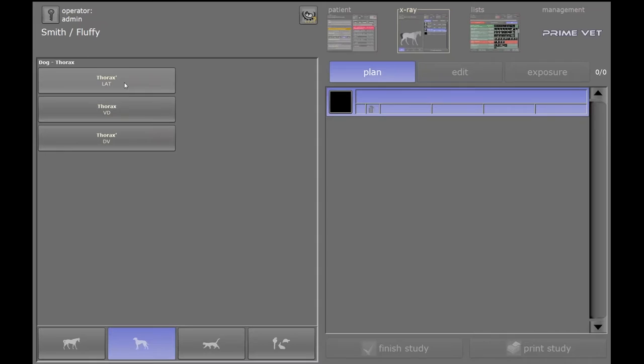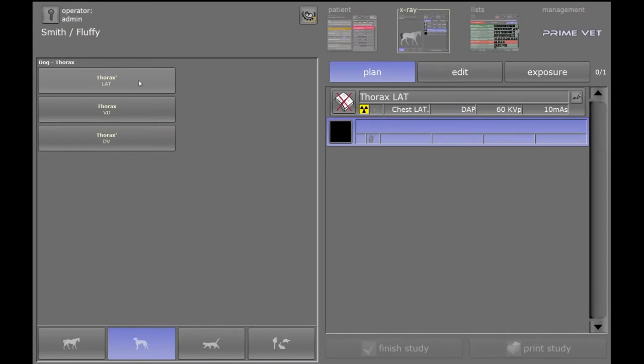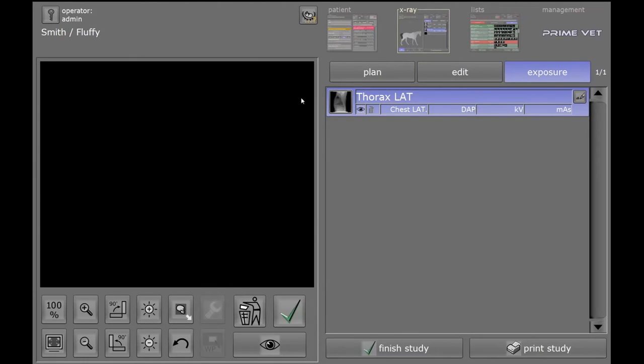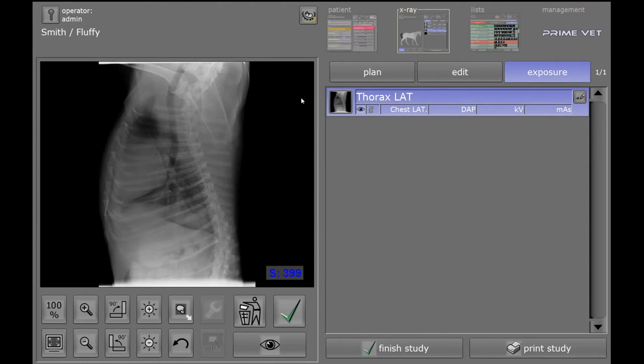Just click on the body part, and the different views will show up. And we can add and change and do whatever else needs to be done. So I'm going to select thorax, go over to Exposure, make the Exposure here, and here's our image.